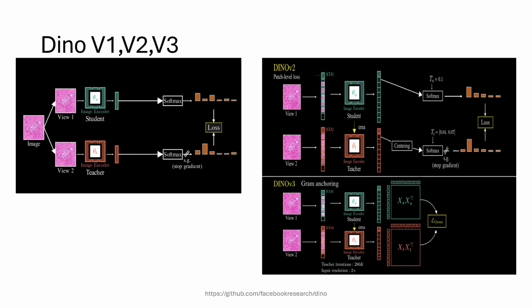So these models are called zero-shot models because you are giving just the image, and from the image they are getting all the information. So while taking a foundational model, either you can go for a CLIP-like thing, or you can go for a Dino-like thing, and more models are to come, all consisting of transformer networks only.